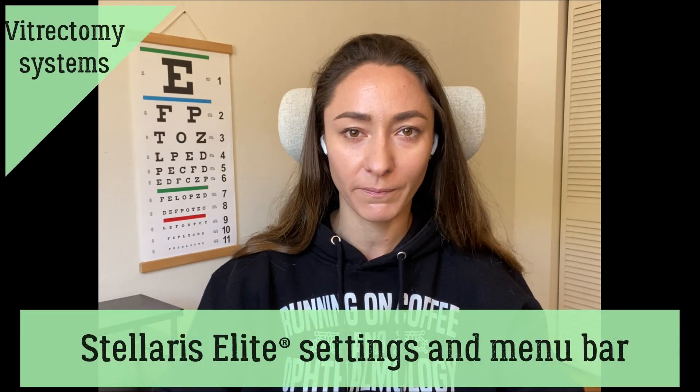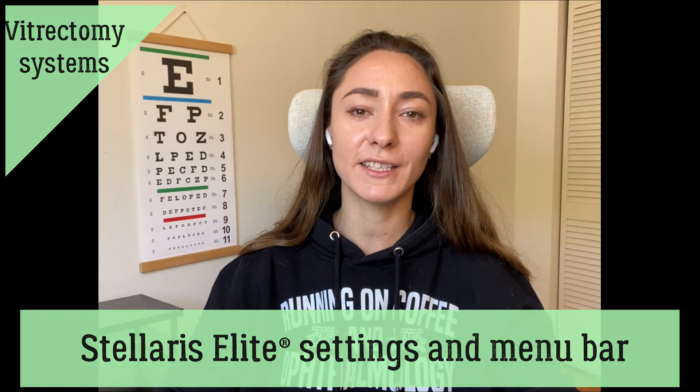Hi, my name is Anfisa, this is RetinaCoach. Today we'll continue discussion on different vitrectomy systems. If you haven't watched our previous videos, I encourage you to visit our retinacoach.com website and also our YouTube channel. In this video, I will dive into the menu bar of Bausch & Lomb Stellaris Elite Vitrectomy Machine. And of course, I remind you that this video was prepared for educational purposes only.